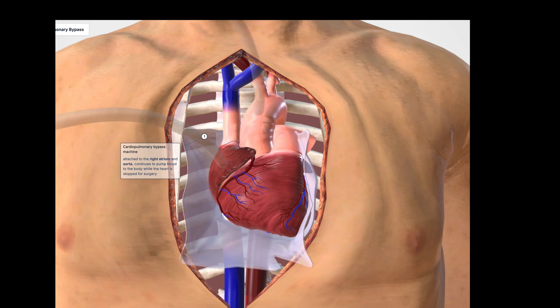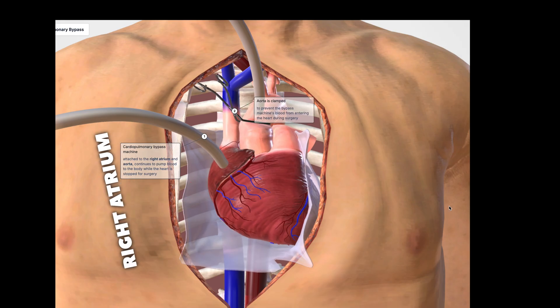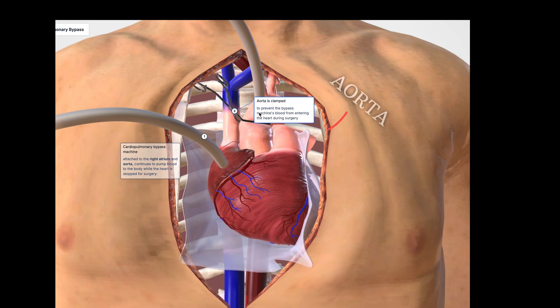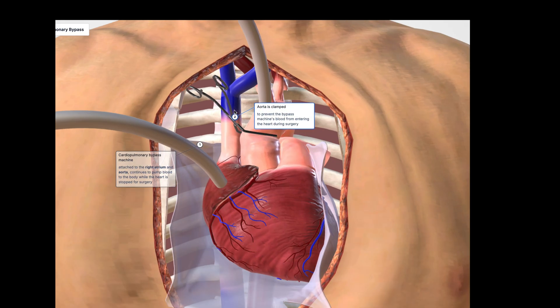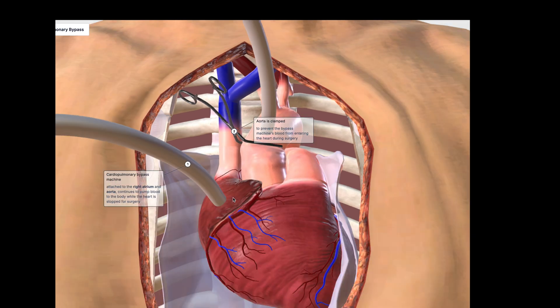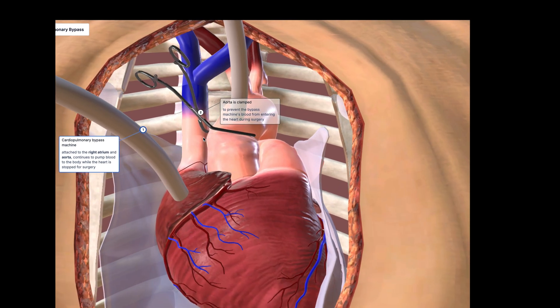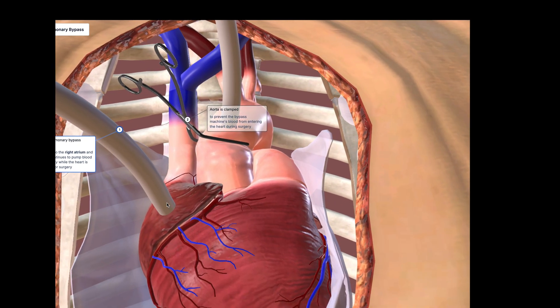Cannulas, or hollow tubes, will be inserted into the right atrium, the small pumping chamber of the heart, and the aorta, the biggest artery of the body. These tubes will pump the blood into a machine that oxygenates and circulates it back into the body.